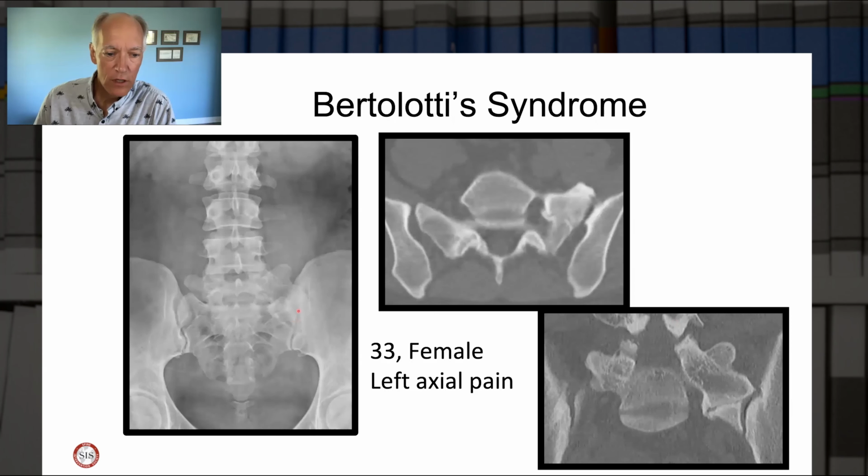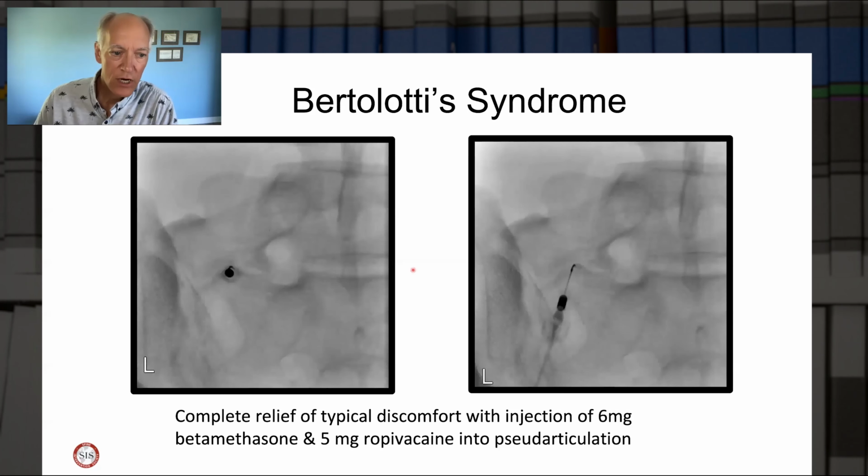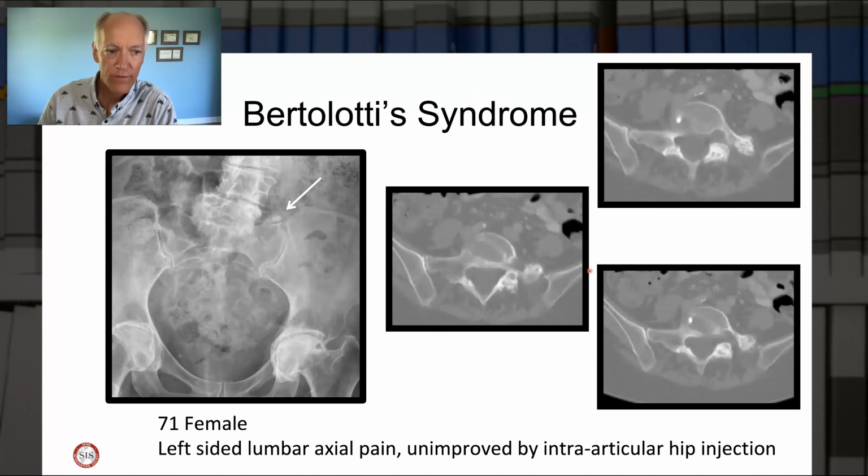Another example, a relatively young female, left-sided axial pain, pseudarticulation. And here is a CT showing this very unusual looking pseudarticulation with some osteophytic formation. You can see where this could be moving towards that far out syndrome out here. And here on a coronal CT reconstruction, there's the osteoarthritic change with some sclerosis and these osteophytes, which are going to encroach close to that exiting lowest lumbar nerve there. And this patient, we injected into that pseudarticulation because they had axial pain. And again, this was one where there was a pseudobursa and just accumulation in a constrained space here. And they did indeed have pain relief.